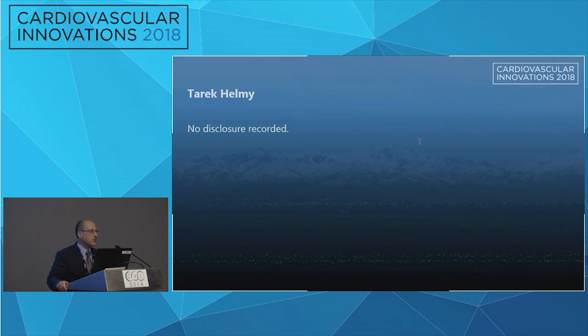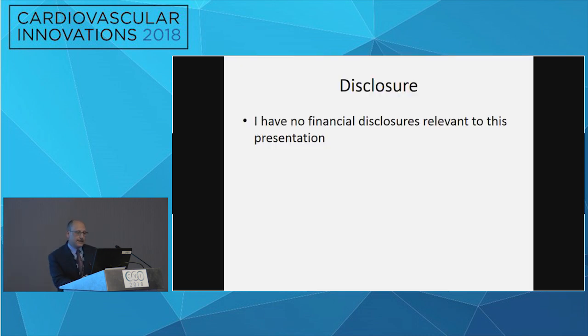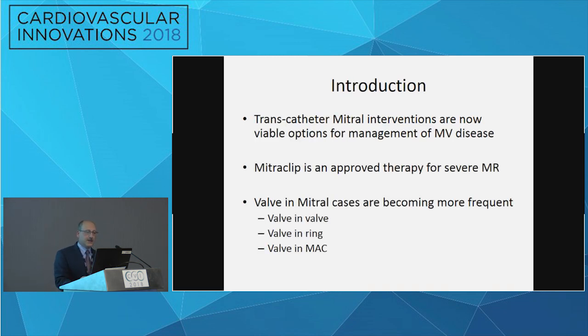Hello, everyone, and thank you to the organizing committee and the moderators for the opportunity to present. I'm going to use this opportunity to present to you a novel technique to prevent or minimize LVOT obstruction when doing TMVR, and I'm going to use a couple of illustrative cases. I have no financial disclosures in relation to this talk.